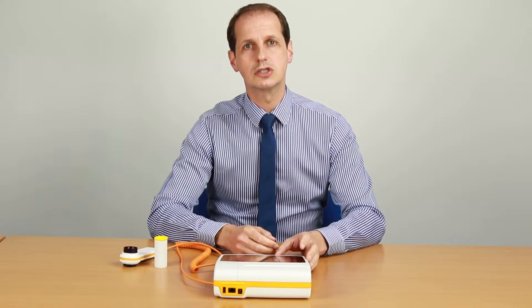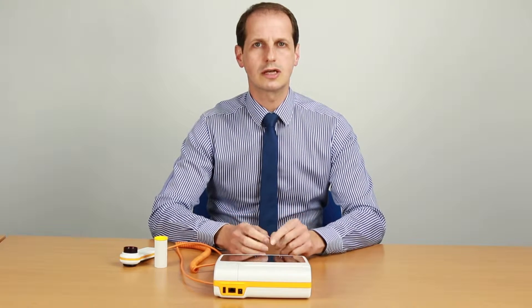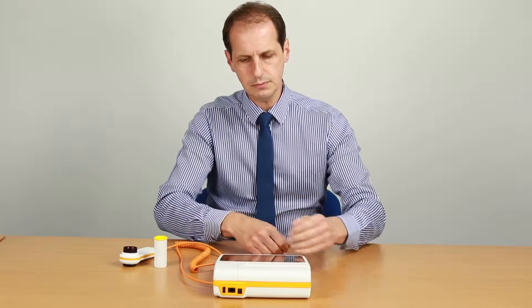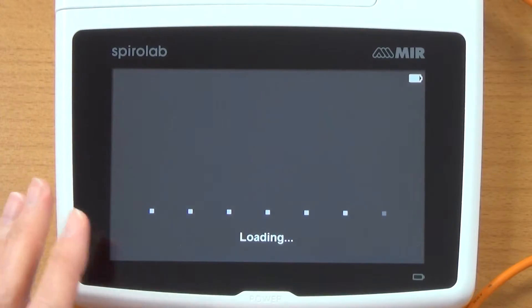It has a large memory storage and a high resolution, large touchscreen display. The on and off key is on the front here. If you switch it on, it's very quick to boot up.